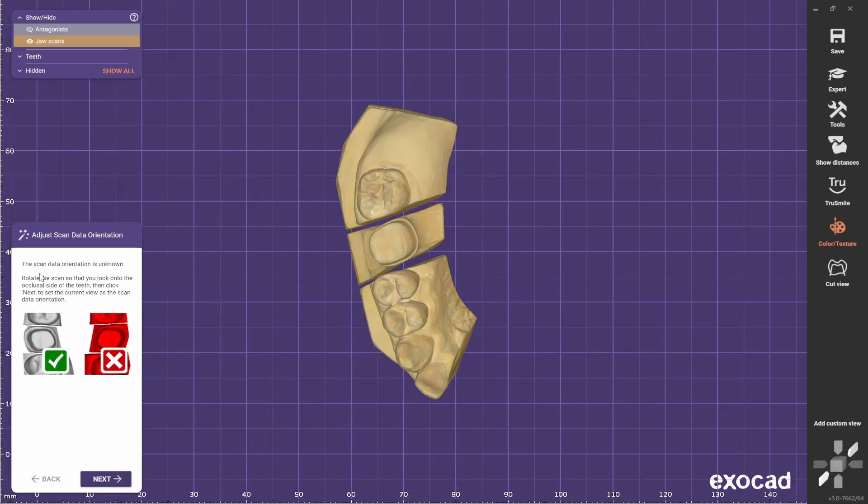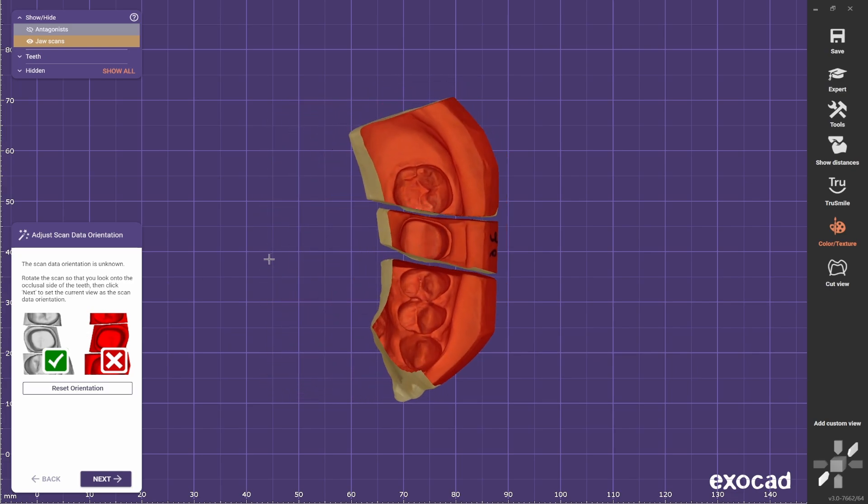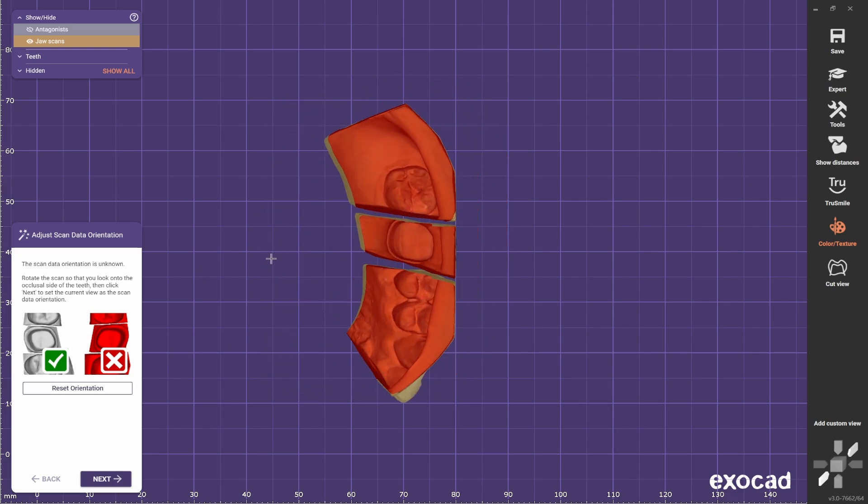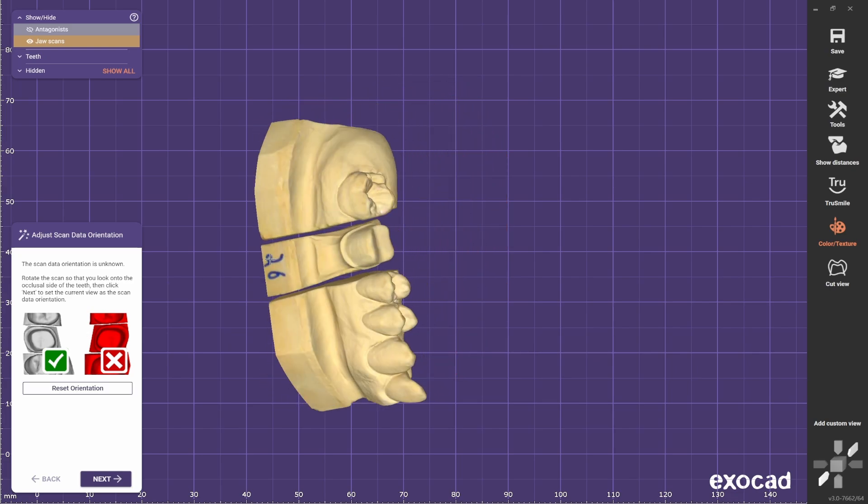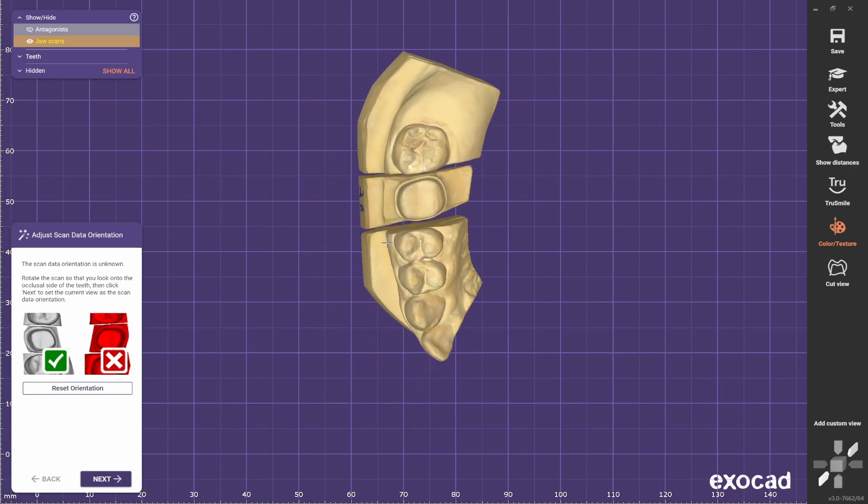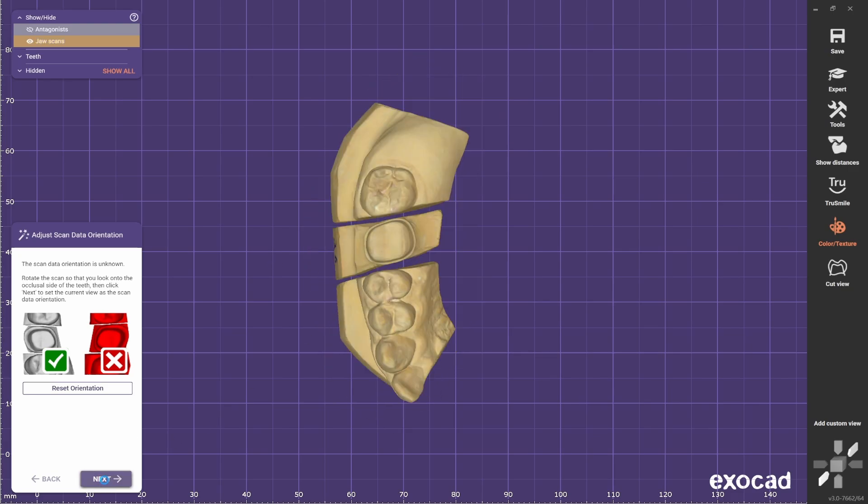Now if you see this image, you need to see the model with color or grey and not red. Because if you see red, it's because you are seeing it from the bottom. So make sure that you are seeing it from the top and press next.